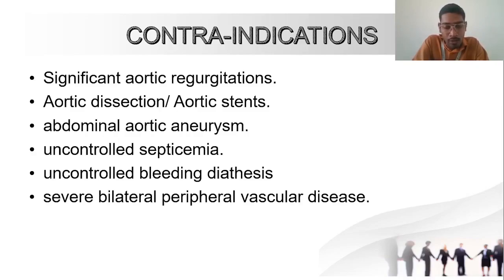And also peripheral vascular diseases. You know what peripheral vascular disease is. In these patients, the procedure cannot be given.